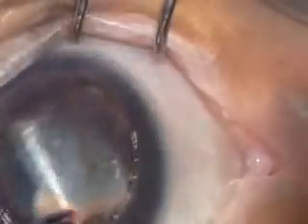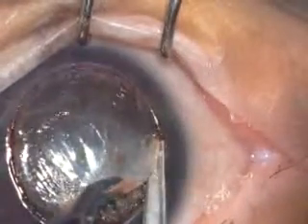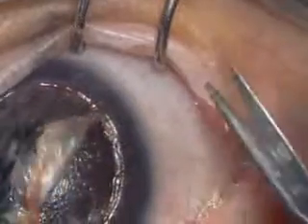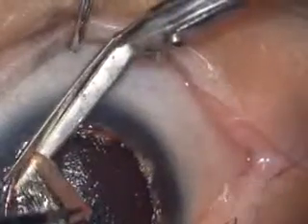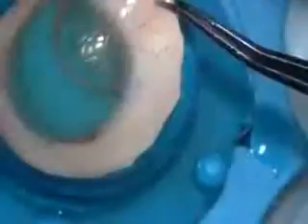Once the entire dissection in the area of trephination has been completed, a curved scissors is used to excise the dissected lamellar margins at the edge of trephination. Care should be taken to avoid leaving any ledge of stromal tissue. The donor tissue is then mounted on an artificial anterior chamber.